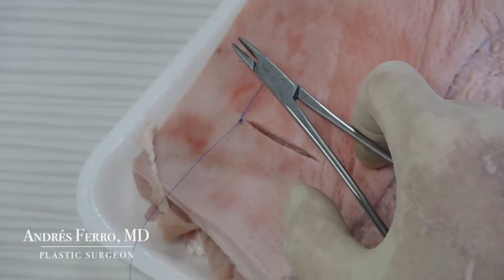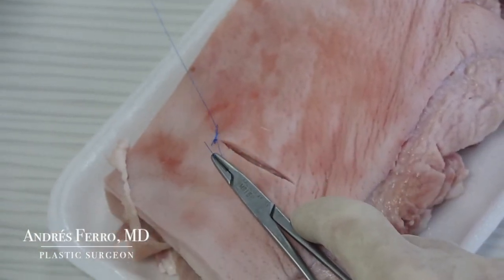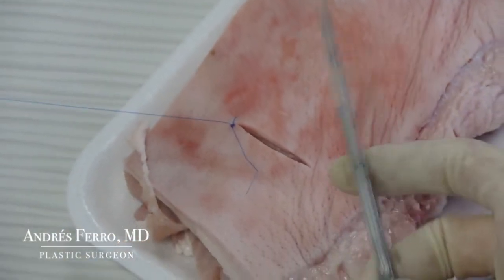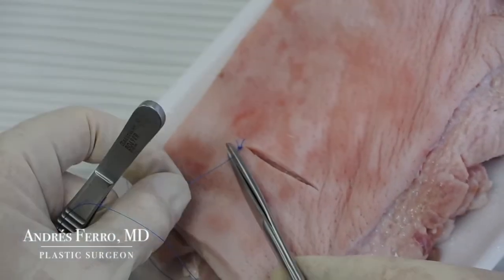In general, it is recommended for monofilaments to make 4-5 knots. However, for training purposes, to acquire skills in making knots, I recommend that you do 10-15 knots at each stitch to develop the skill and mobility of the carpus. Once the knot is finished, cut the ends of the knot with scissors.